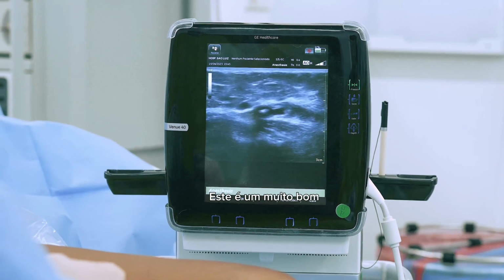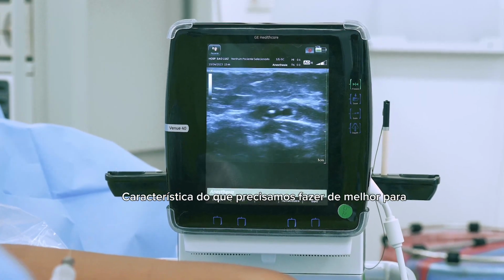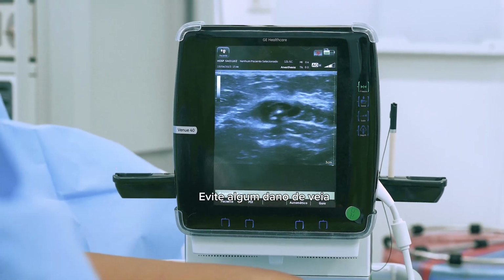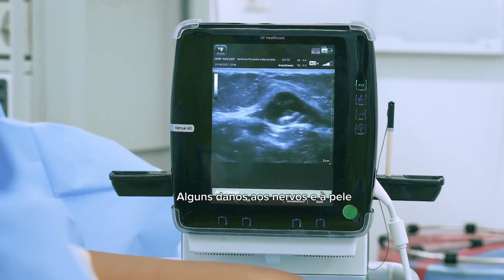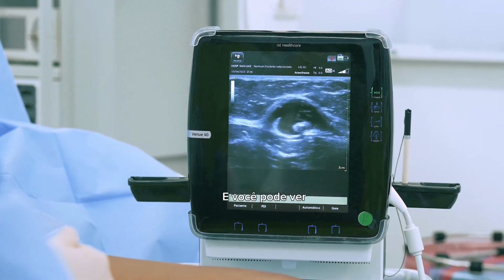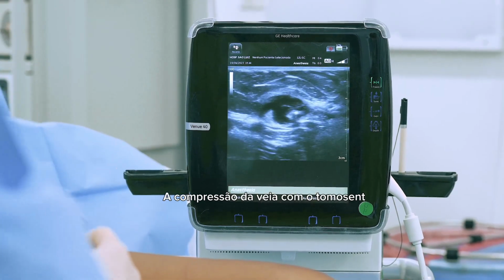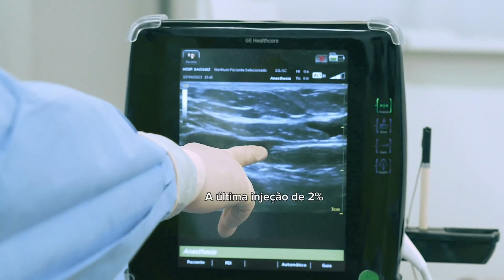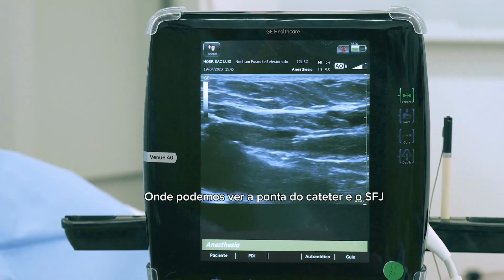This is a very nice picture of what we need to do to best avoid some damage to veins, some damage to nerves and the skin. So this is the best tumescent inside the fascia, and you can see the compression of the vein with the tumescent.